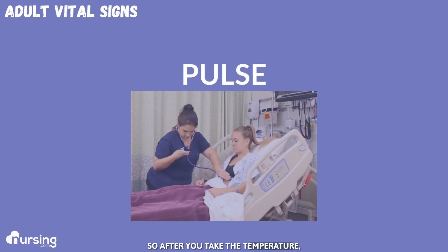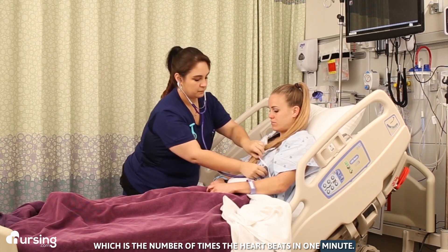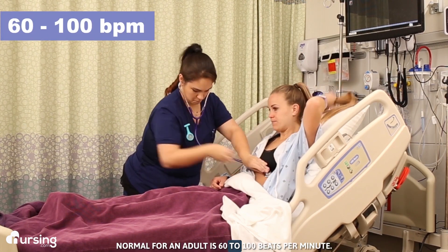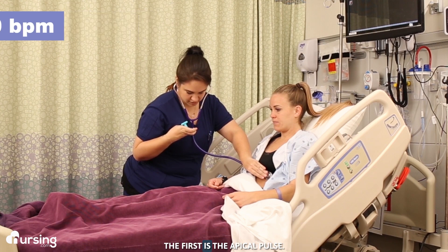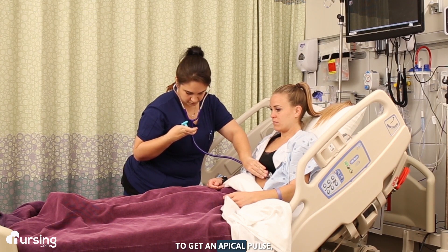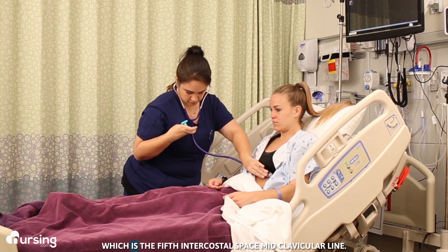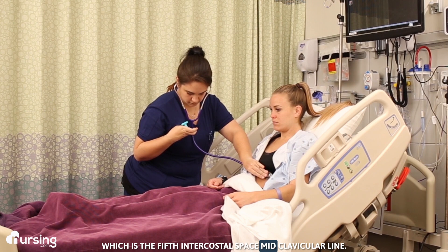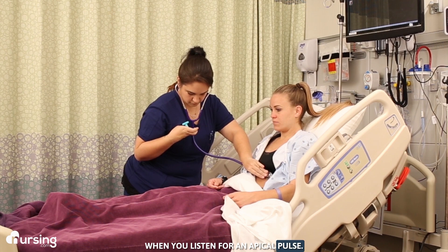After you take the temperature, you want to take the pulse, which is the number of times the heart beats in one minute. Normal for an adult is 60 to 100 beats per minute. When checking a pulse you have a few options. The first is the apical pulse. To get an apical pulse, place the diaphragm of your stethoscope over the apex of the heart, which is the fifth intercostal space midclavicular line, and listen for a full minute.